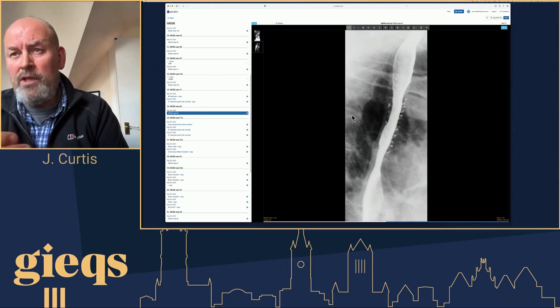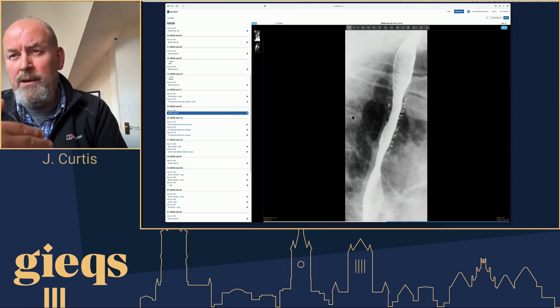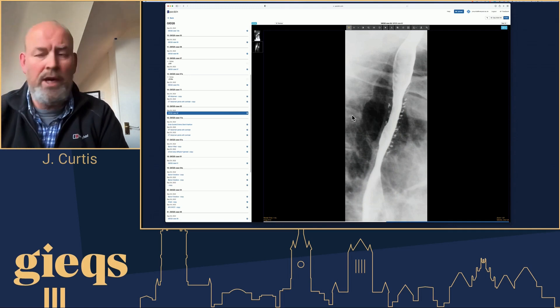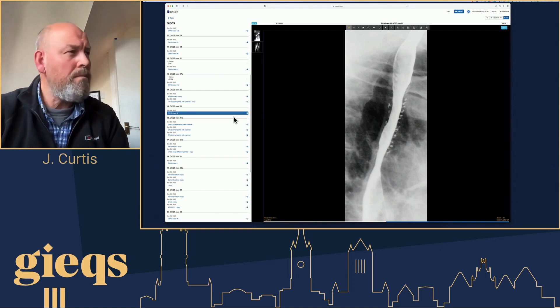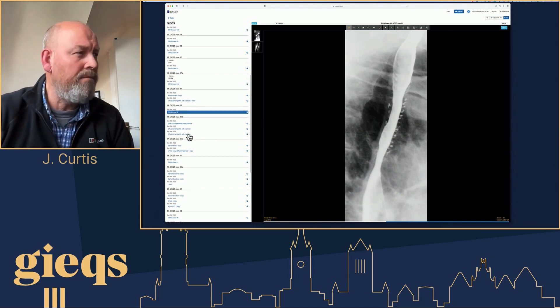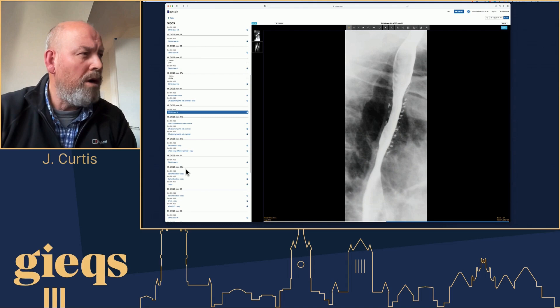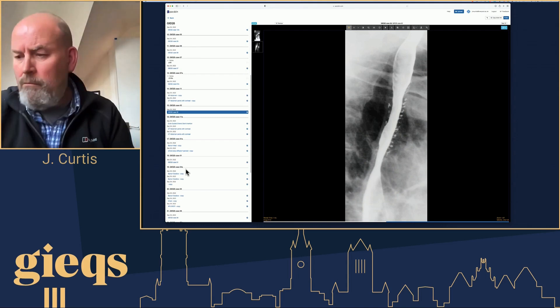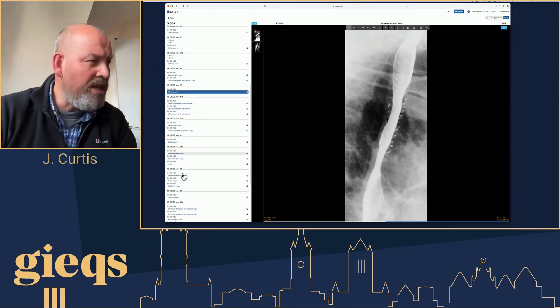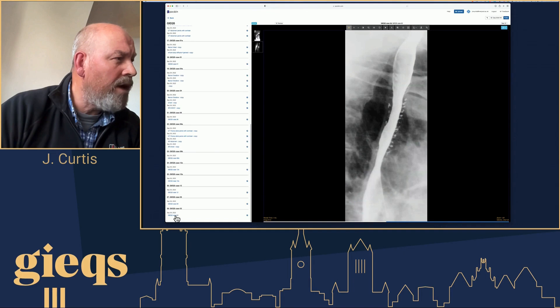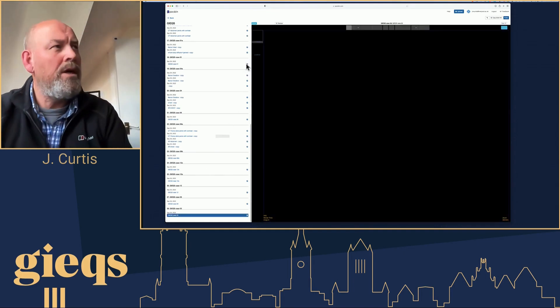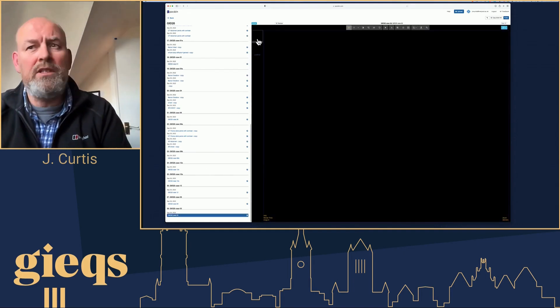Always remember that the esophagus is behind the trachea, which is anterior. You can go through these images at your leisure. Case number three is number 28 — a patient presenting with dysphagia.